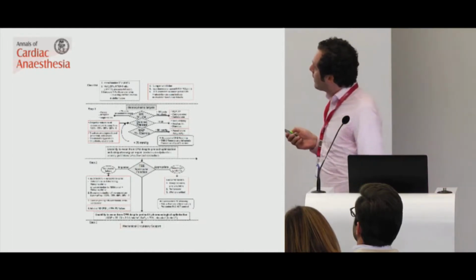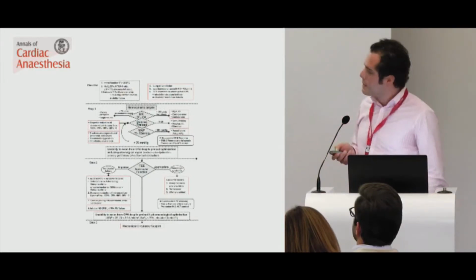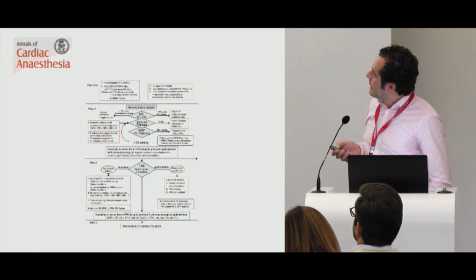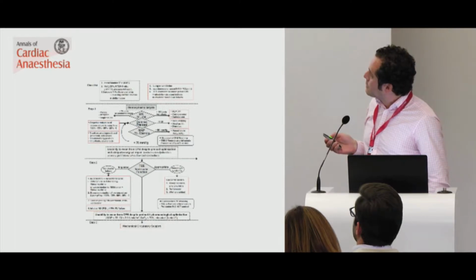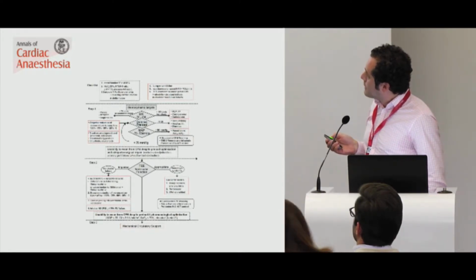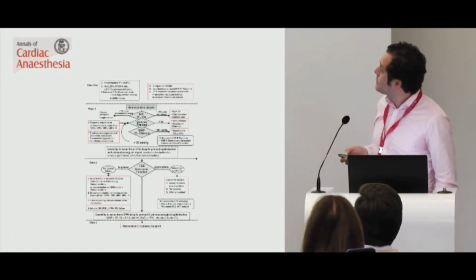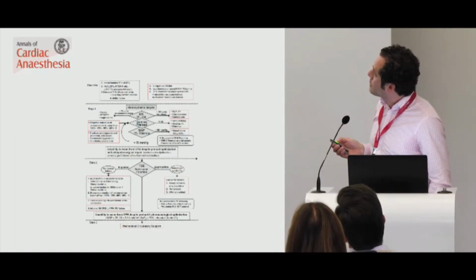I'm glad that I put a checklist in, and I'm sure we all have in our heads mnemonics that we teach our trainees about the different ways that we need to come off bypass. So temperature, obviously very important, and once the cross clamp is off and we're warming, we would make sure that we have our warming devices in. Looking at the post cross clamp gases, we're looking at potassium, base excess, pH, glucose control.